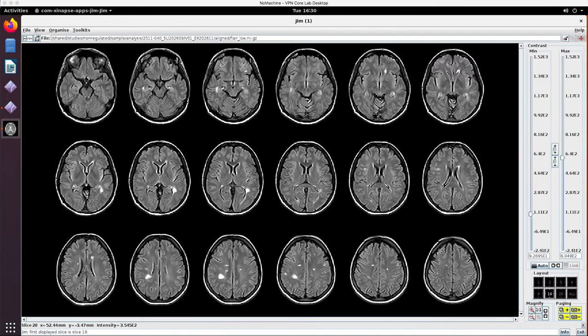But very briefly, what are T2 lesions? They are alterations in the T2 property of the tissue. This is a little bit of an esoteric concept. It may not be obvious to you what T2 means, and it really has to do with the interchange of energy from different spins. It doesn't really matter other than to say that it's a measurable property that all tissues have, and that as the tissue has a higher water content, you tend to see increased T2 times. So they take longer to dephase.